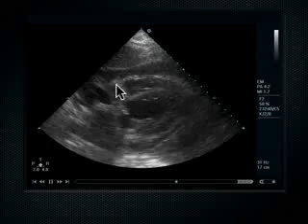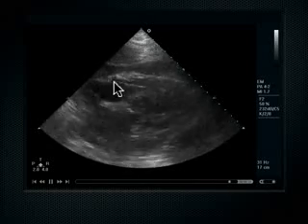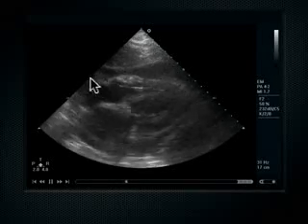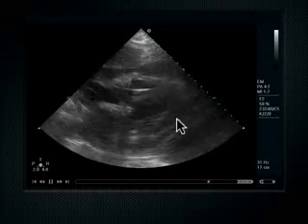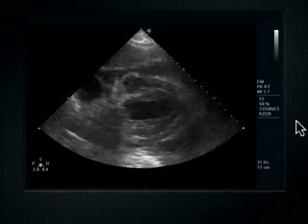Well, on ultrasound, you can see the guide wires coming into the RV. Not only can you help guide the guide wire in, this is a subxiphoid view, because that's the liver. Not only can you guide the guide wire, but you can also see when the electrical activity becomes mechanical capture as well. And so you can see all of a sudden when you get in the right spot and when you start to see the heart become mechanically captured.